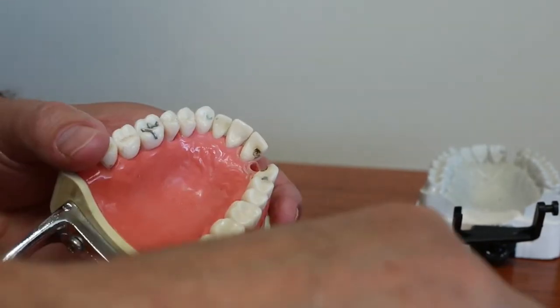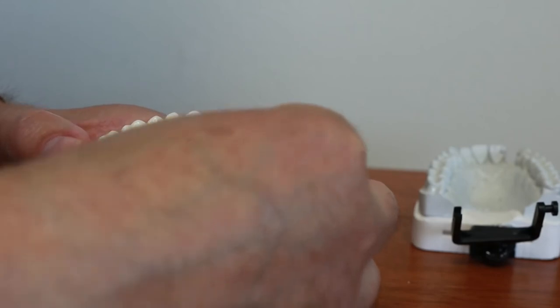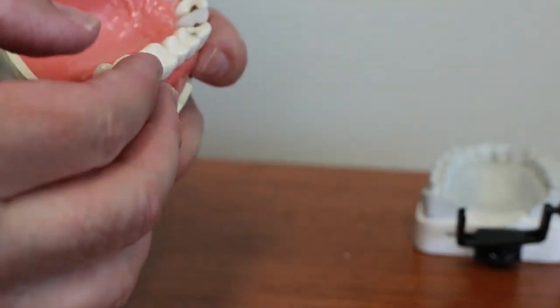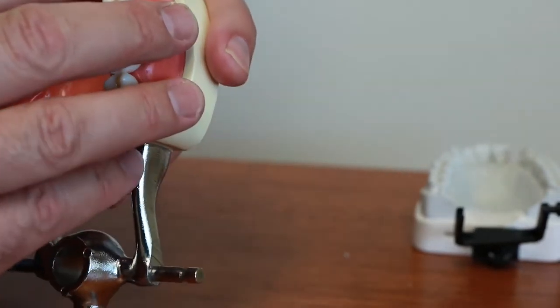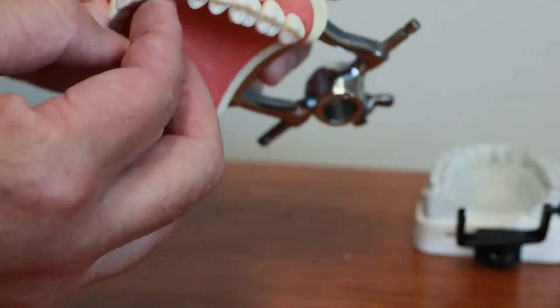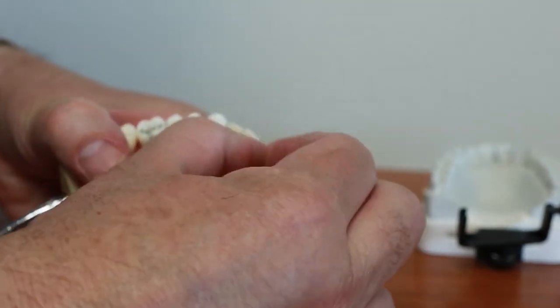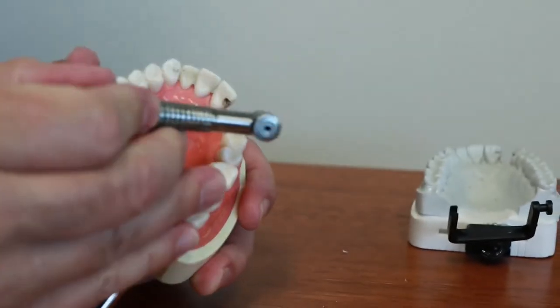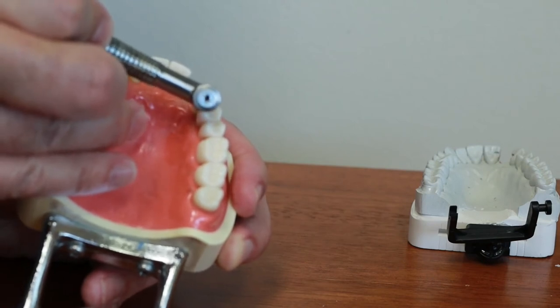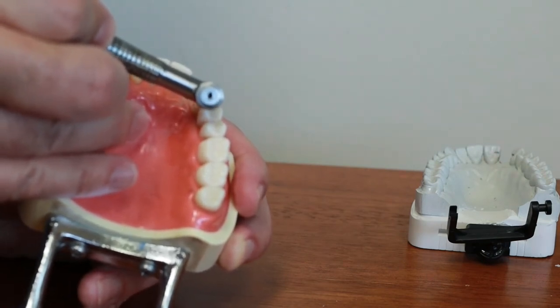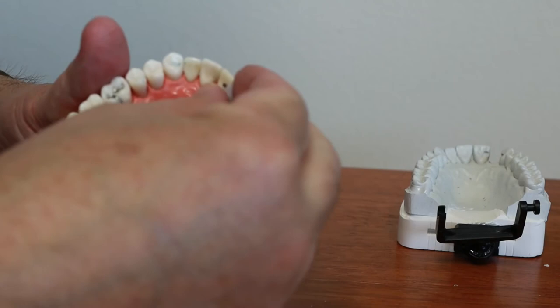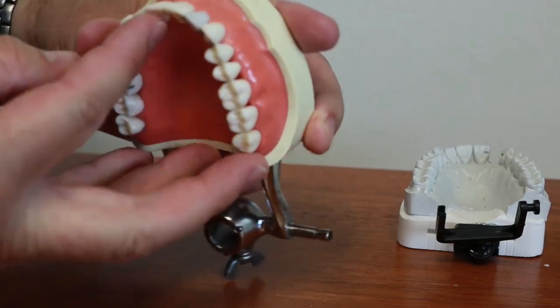Even if you do make the preps a little bit too big it's not the end of the world since it's going to be filled in with composite that you're going to bond the bridge in. Almost there. I think I just need to make the canine prep a tiny bit deeper so that it sits properly. Let's check the guide. I think it needs a tiny bit more. The tooth's a little twisted. And check one more time.